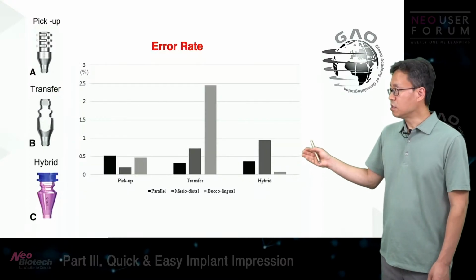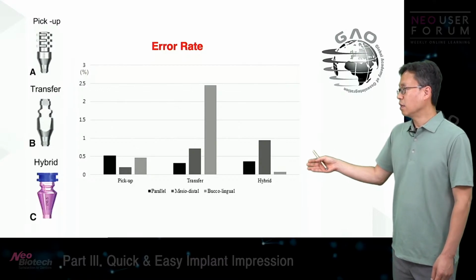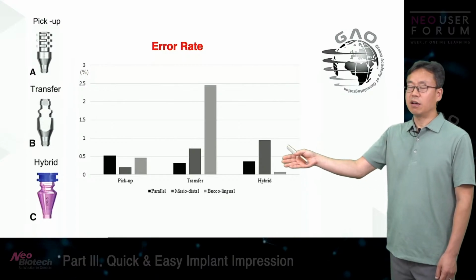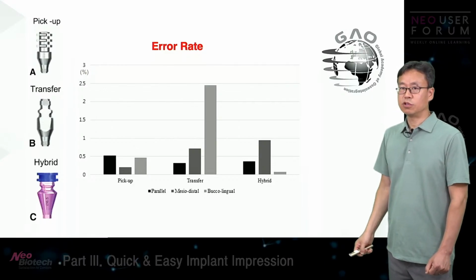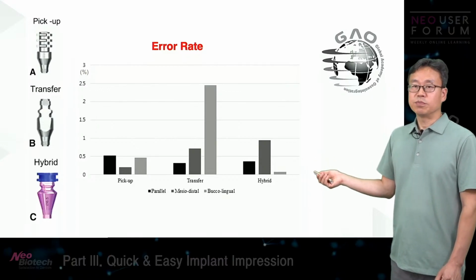From this study, we realized that the hybrid system or the PCAP system is as accurate as the pickup impression system, which is pretty good.